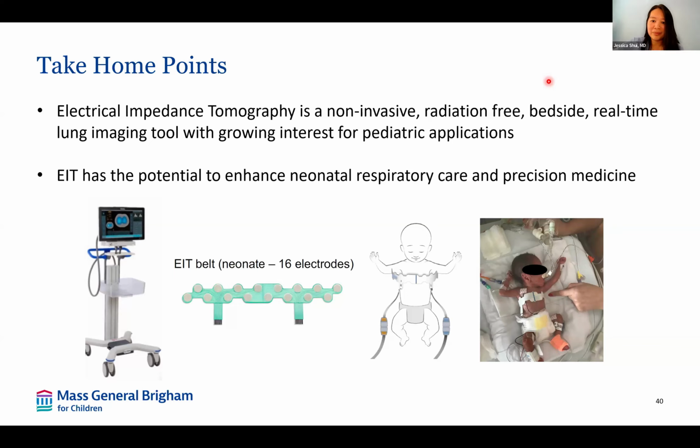The next question is about your PEEP titrations and whether you use muscle relaxation or if these patients are spontaneously breathing. Great question. Some patients were muscle relaxed and others were spontaneously breathing. For our controls, all of those patients were about to have non-pulmonary related surgery, for example removing a polydactyly finger or things like that, so they were all sedated and muscle relaxed. But for the BPD population, out of the 5 assessments, some were muscle relaxed and some weren't. The one that failed was spontaneously breathing.